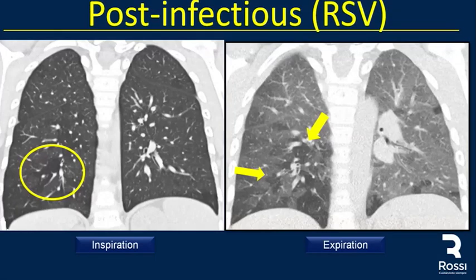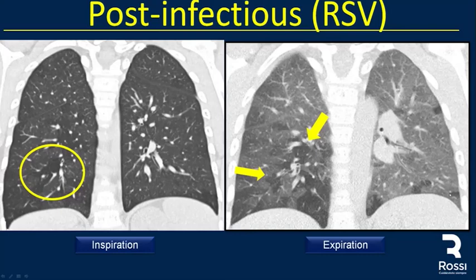In post-infectious disease, you can see several areas of mosaic attenuation — normal lung and areas of low attenuation. We perform expiratory CT and we can see areas of air trapping, mainly in the right lung and some small areas of air trapping in the left lung.